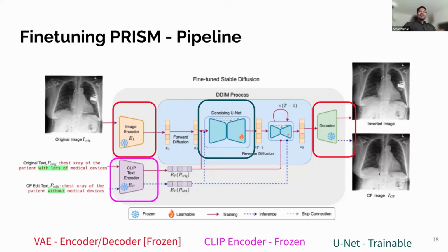And all that is happening with this backbone of a foundation model, which is trained on natural images, this Stable Diffusion. And we fine-tune just this central component, the UNet, for medical imaging tasks. And it's very beautifully able to perform these tasks without any extra supervision.